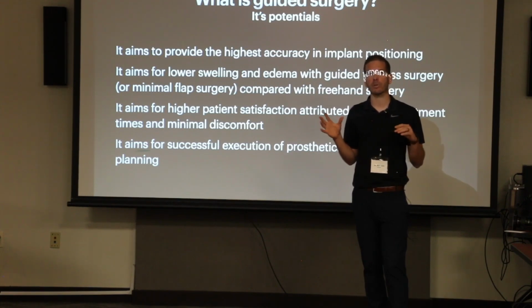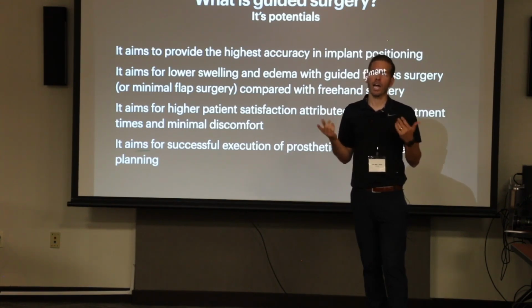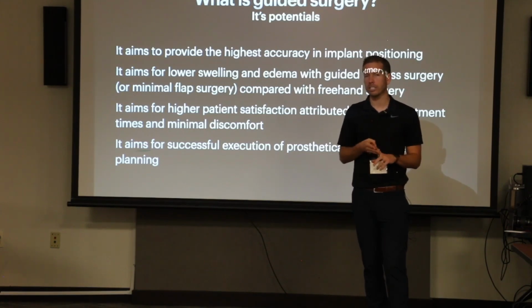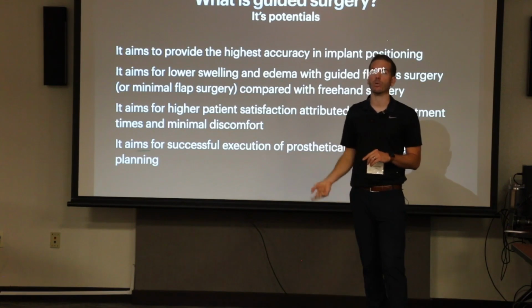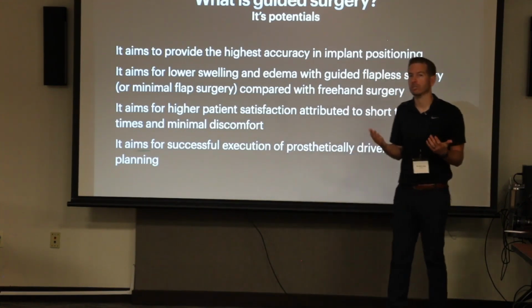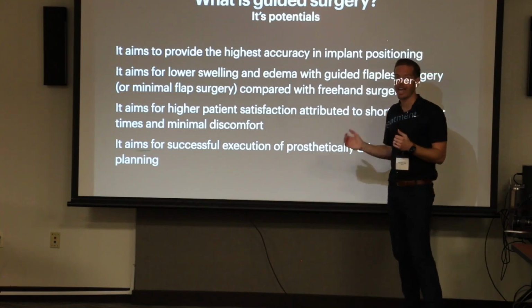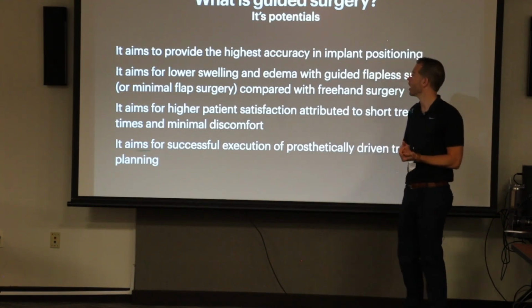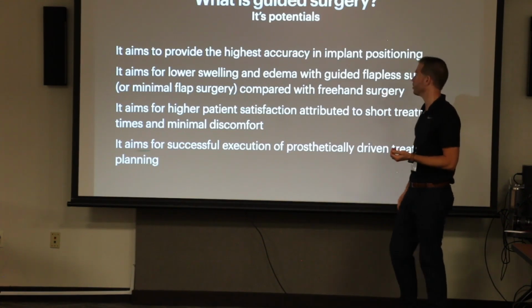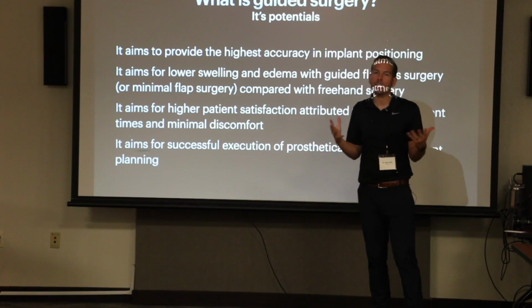So today's not so much about how deep should my implant be necessarily, or what implant should be, or the surgical considerations, but it's how do we design something that'll get us to that. So we still have to have the proper surgical training and restorative training, but this is how to execute that predictably every time. It aims for lower swelling and edema with more minimal types of surgeries.